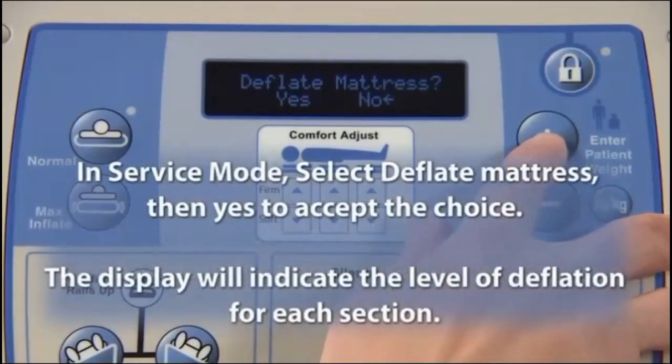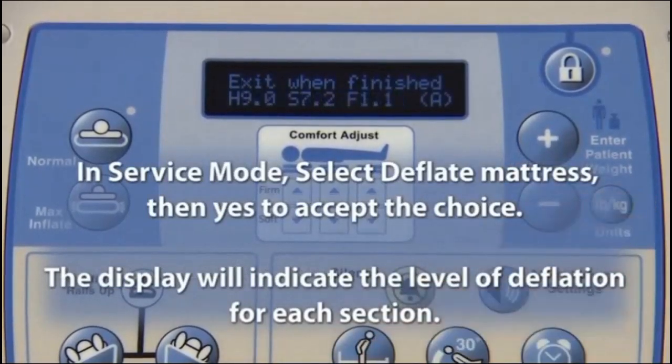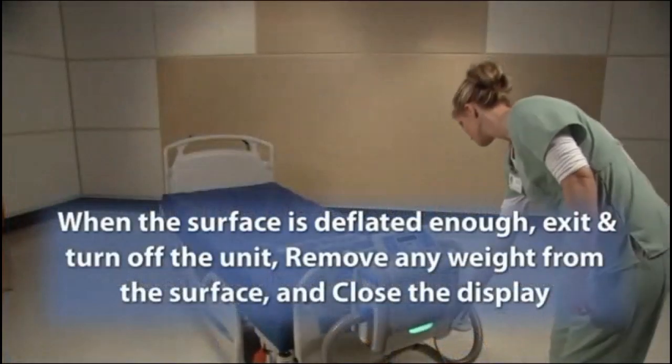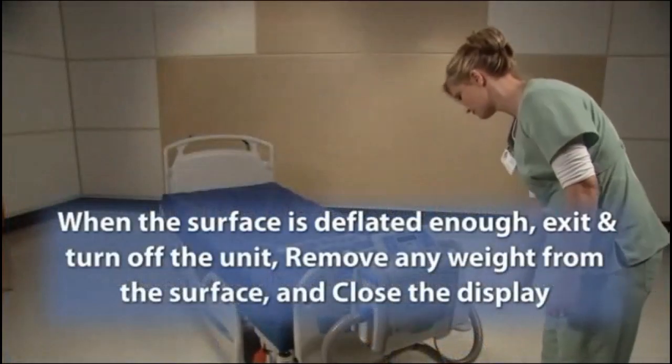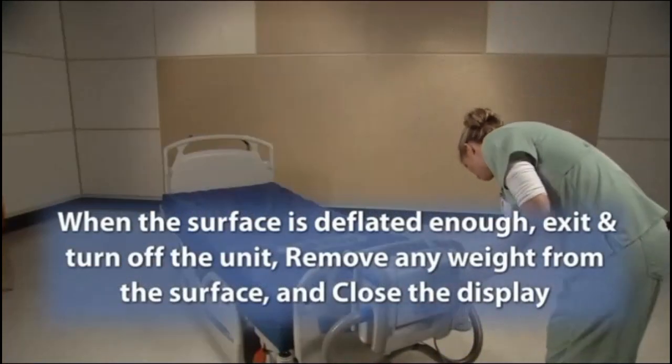In service mode, select Deflate Mattress, then Yes to accept the choice. The display will indicate the level of deflation for each section. When the surface is deflated enough, exit and turn off the unit. Remove any weight from the surface and close the display.